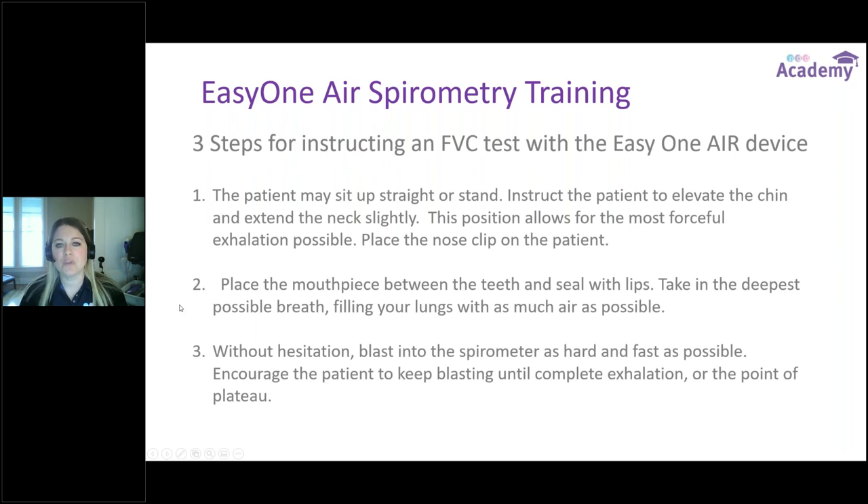The steps for instructing an FVC test on the EZ1 Air: the patient can sit up straight or stand if more comfortable. We always want to instruct the patient to elevate their chin off their chest, extending the neck slightly — this allows for the most forceful exhalation possible. Always place nose clips on the patient to capture every last bit of air. Have them place the mouthpiece — the flow tube mouthpiece — with teeth on top, tongue on the bottom, making a good tight seal with their lips, not playing it like a trumpet or obstructing the flow tube.